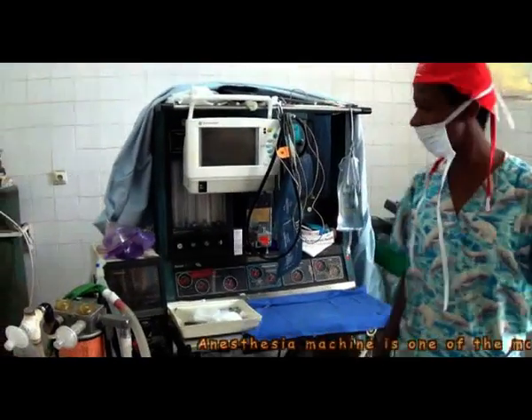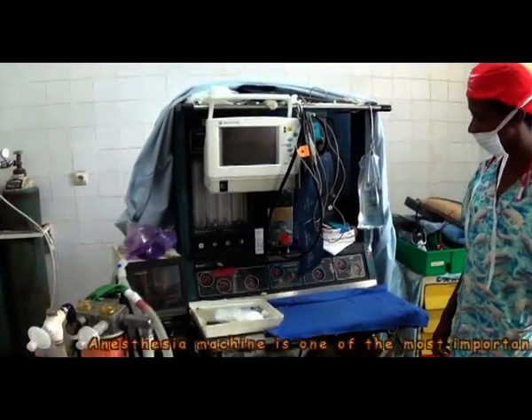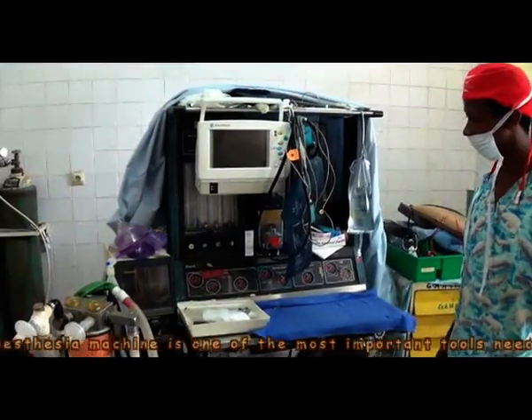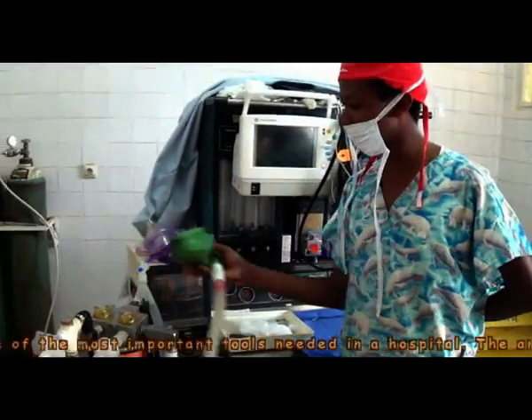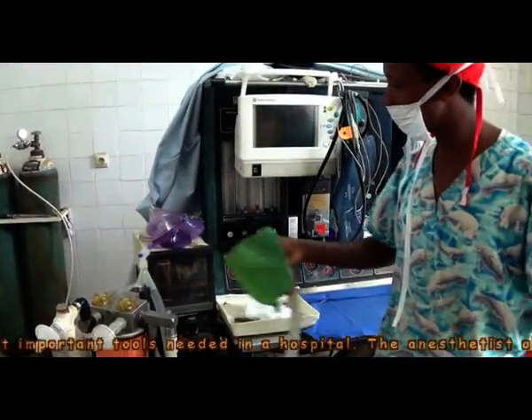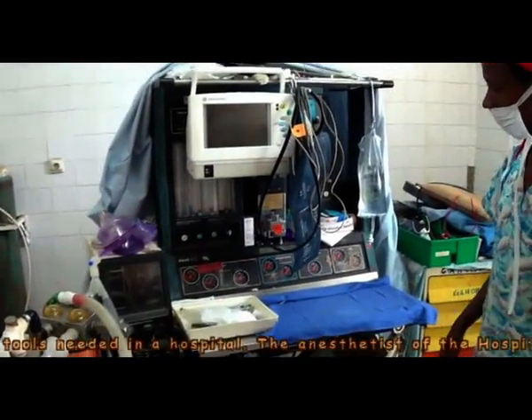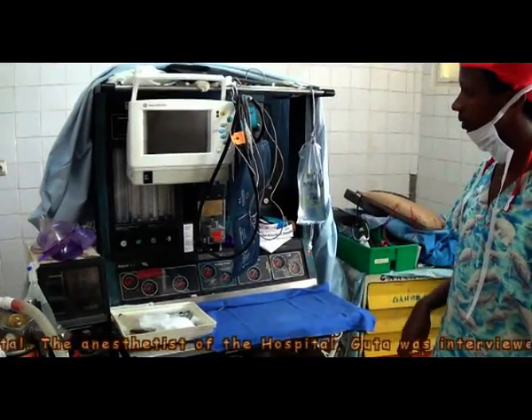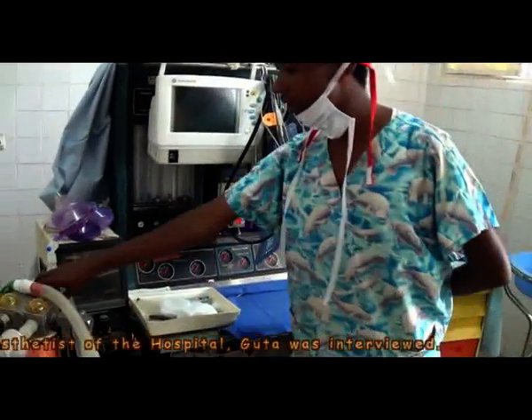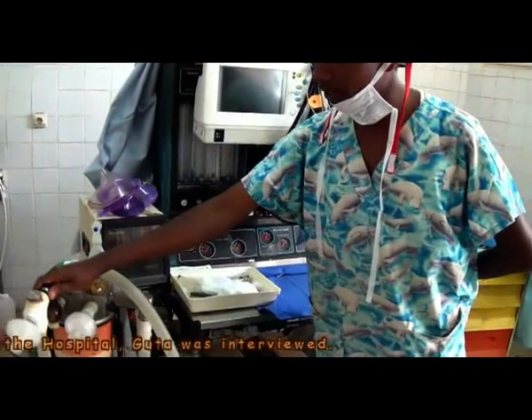Some explanation about this anesthesia machine. Do you have any problem with it? Yeah, it's really difficult to mention because almost all of its parts are not functional right now, because as you can see here, everything is taped.